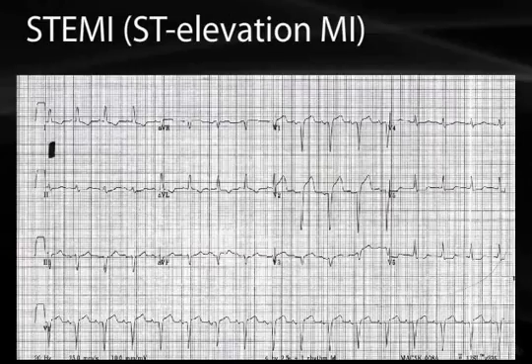ST elevations, seen here in leads V1 and V2, indicate an acute myocardial infarction or a myocardial infarction that is rapidly occurring. The ST segment elevations in this patient appear to be in the septal leads V1 and V2. We would diagnose this patient with a septal myocardial infarction. This patient also has Q waves in leads V1 and V2, as well as lead V3. These large Q waves would indicate that the patient already has infarcted or dead myocardium.